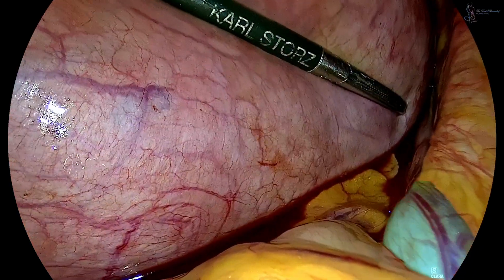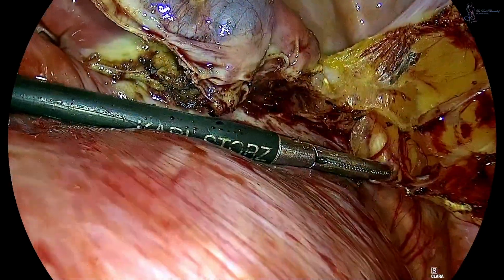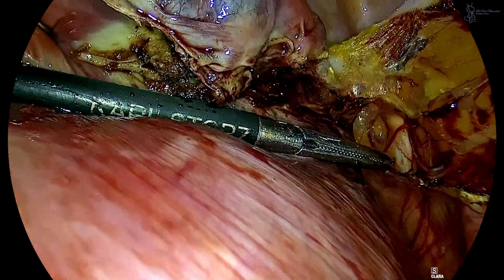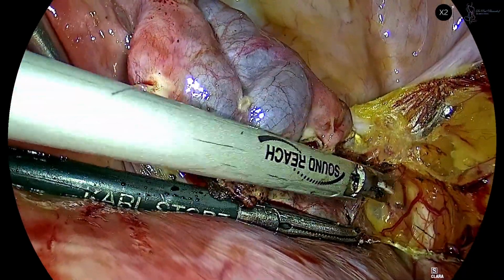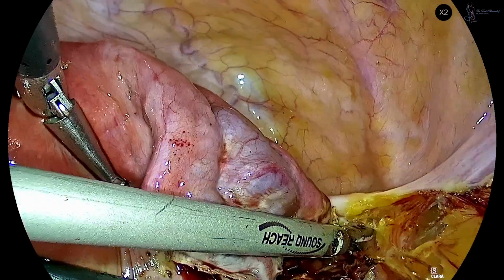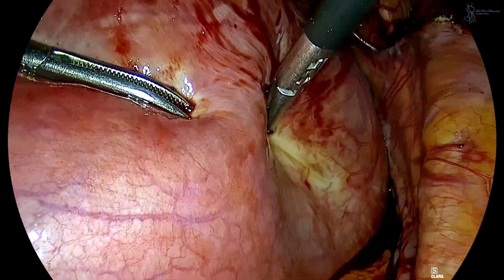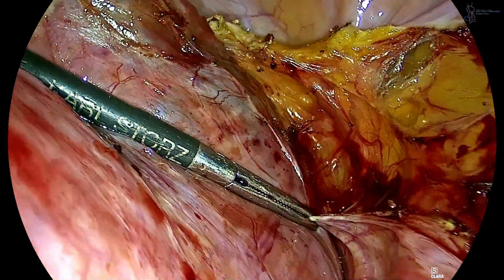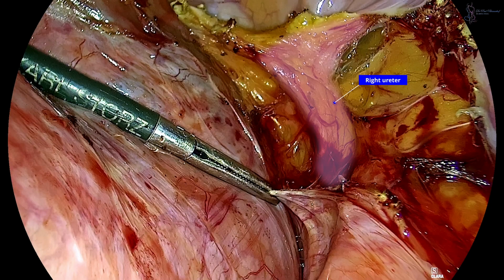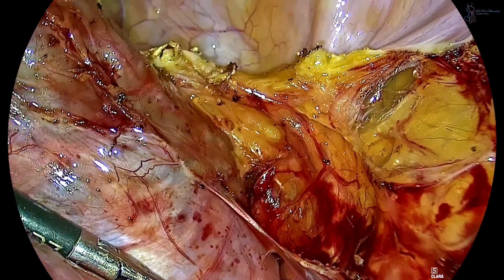Here we can appreciate the course of the right ureter, as highlighted. Dissection and cutting of the right posterior leaf of the broad ligament. Access to the right broad ligament is limited due to restricted space caused by the large myoma. Dissection of the right ureter was performed while attempting laparoscopic uterine artery ligation on the right, but the procedure failed due to limited space caused by the myoma.